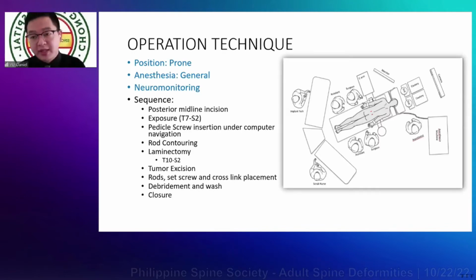So moving on to our operative technique. We place the patient prone under general anesthesia with neuromonitoring, and the diagram on the right is our setup during the OR.